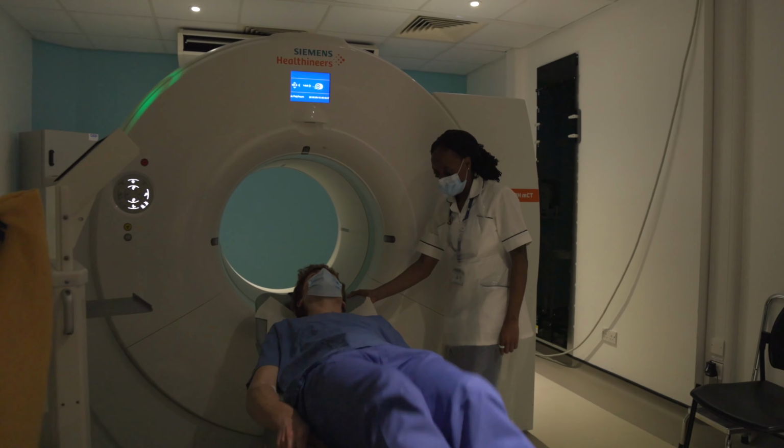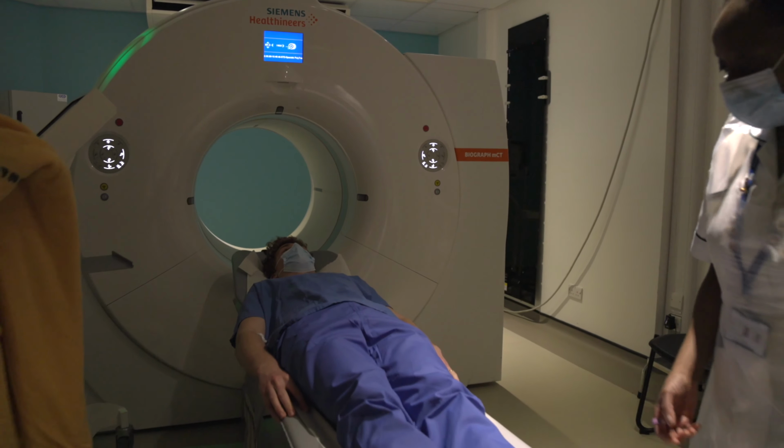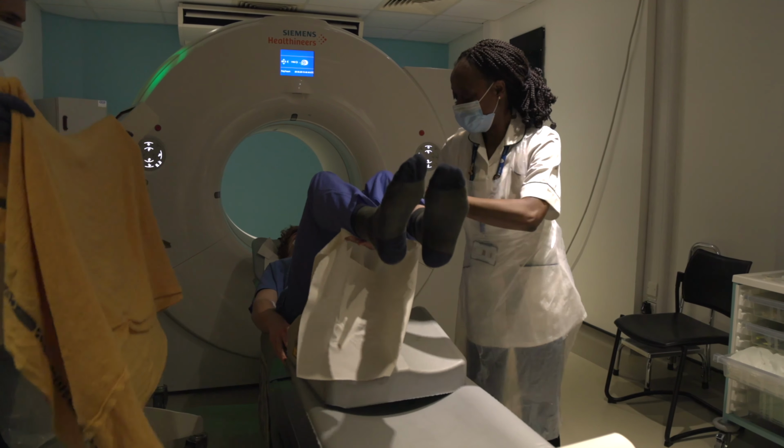The patient will lie on the camera for about 20 minutes whilst we take the pictures, and we'll check these to make sure we've got all the information we need before the patient can go home. Inside this machine is a CT scanner at the front and a PET detector at the back. First we do a CT scan.